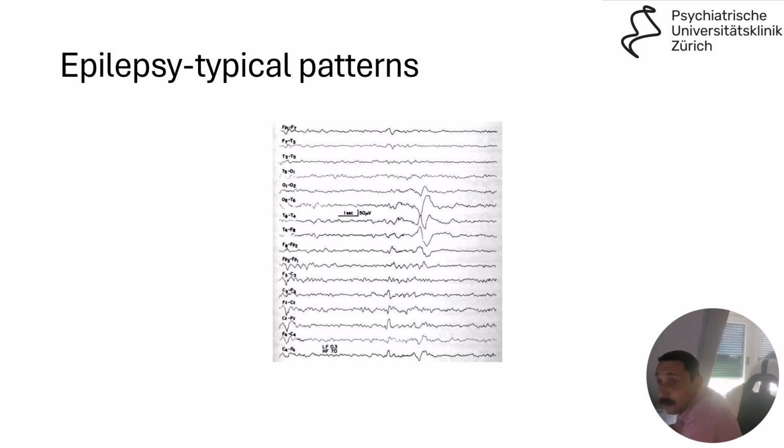And then you have the sharp waves. And here you see the sharp waves, which have a fast decline of activity or amplitude, and large amplitudes which are much higher than 50 microvolts, 70, 80, maybe 100 or even more microvolts should be there, and they should last quite a while, most often in the theta or in the delta range, as you can see over here.